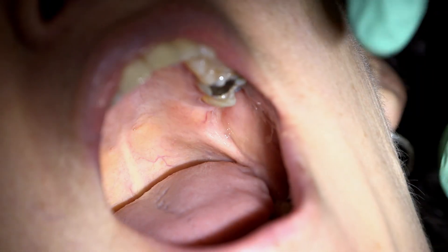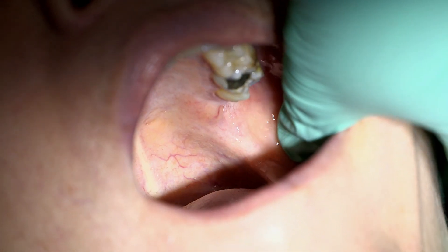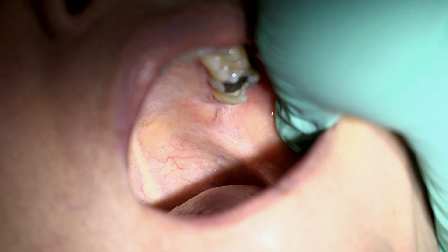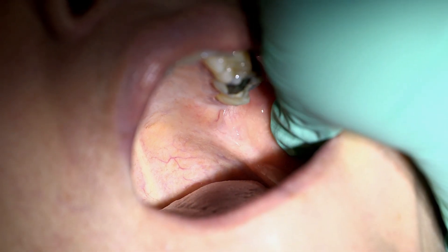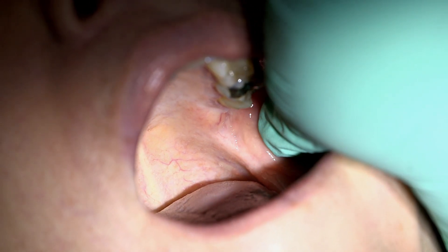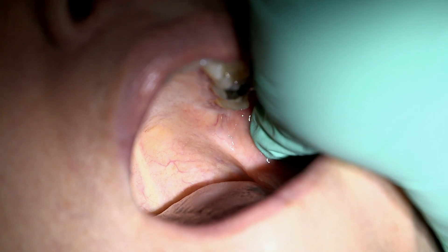We will now perform an inferior alveolar nerve block in quadrant 3. The first thing we need to do is palpate the coronoid notch using our thumb or index finger. Then move the thumb or finger medially to palpate the internal oblique ridge.